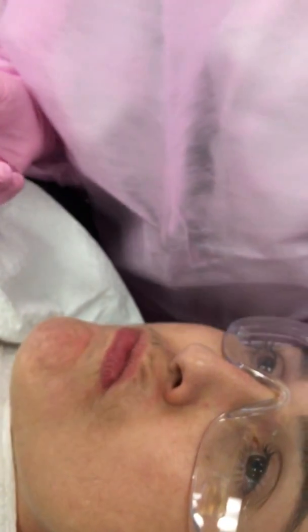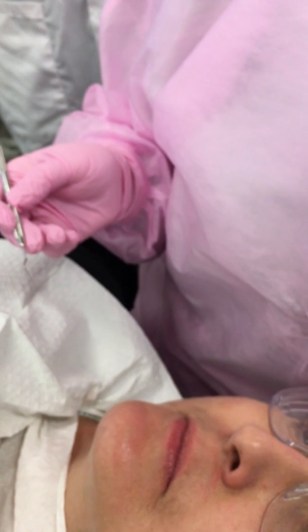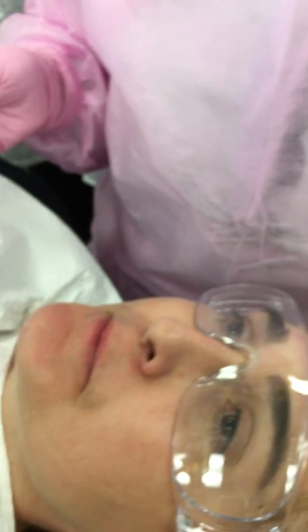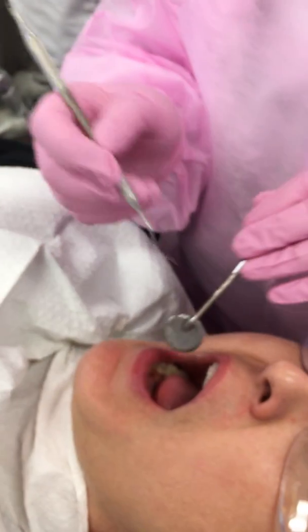Does everybody understand that? If I can add something, the software that you're now using is usually going from the buccal of the upper right arch, so tooth number 1 or 2, all the way up to 16. Then the lingual, go all the way across back to number 2. And then it goes to the buccal of tooth number 31 or 32, and all the way across to 17. So you need to know where you are in whatever software you're using. You have to know where you are in the mouth.